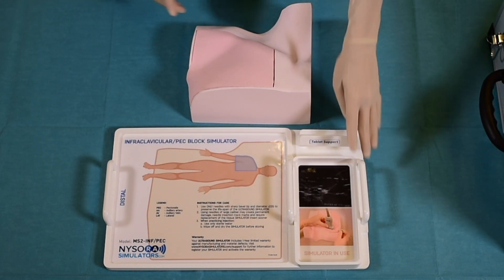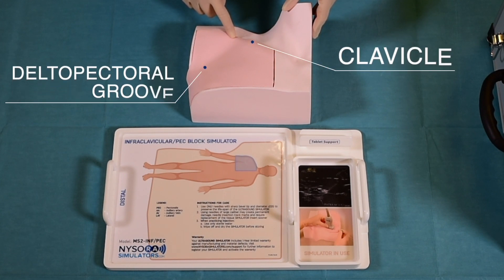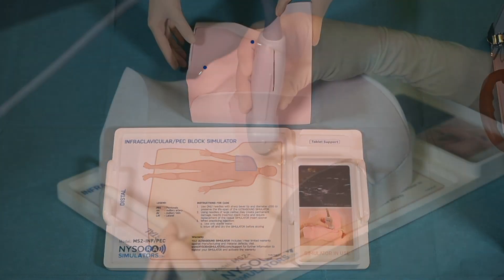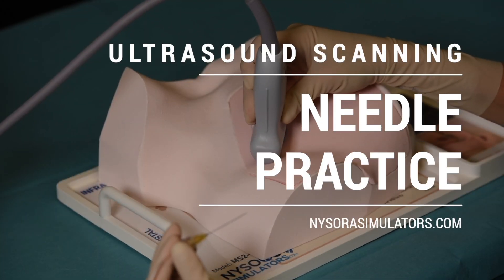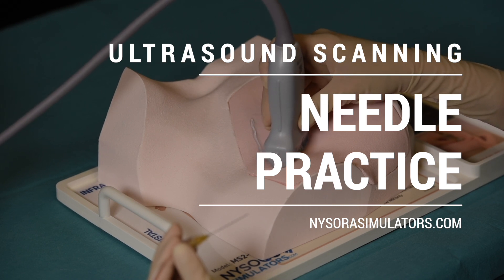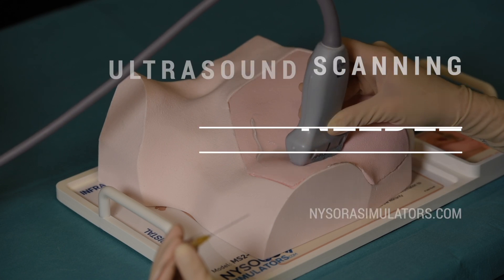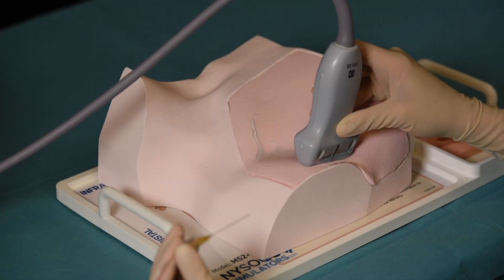The infraclavicular and pec block simulator features realistic surface anatomy. Here, we can see the delta pectoral groove and clavicle. To begin practicing, a liberal amount of ultrasound gel is applied. Before sonographing, it is important to increase the ultrasound gain because of the difference in the simulator material and human tissue.